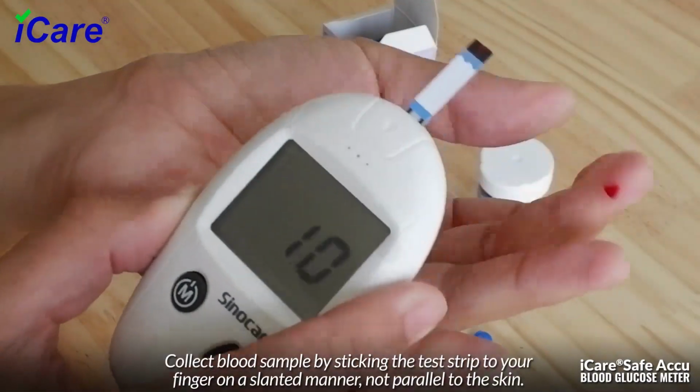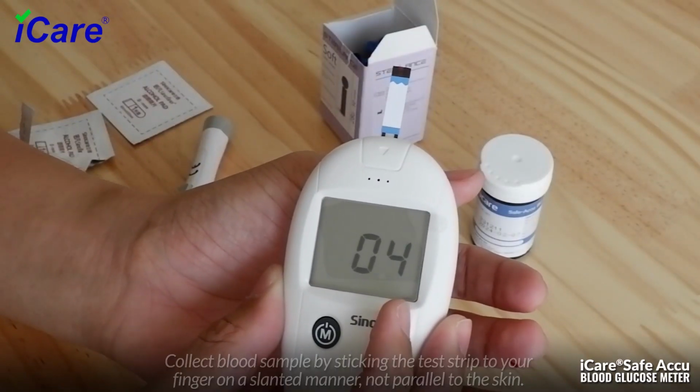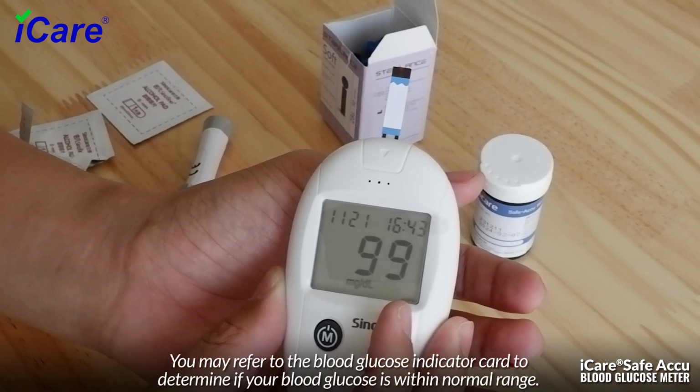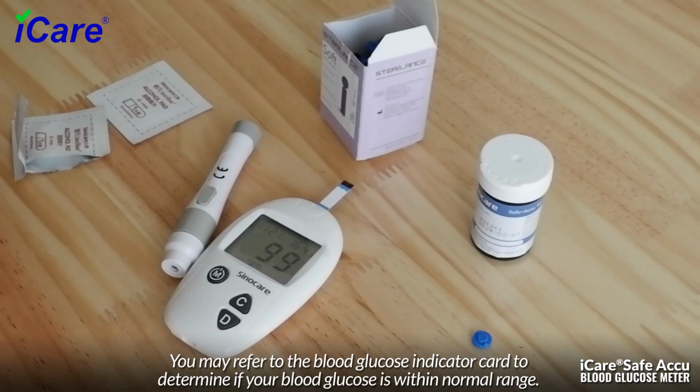Collect blood sample by sticking the test strip to your finger in a slanted manner, not parallel to the skin. It only takes 10 seconds for the results to appear. You may refer to the blood glucose indicator card to determine if your blood glucose is within normal range.